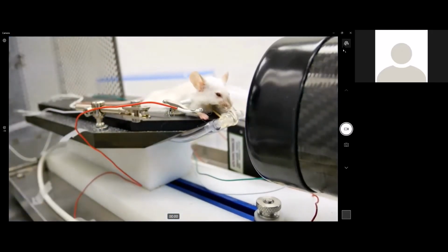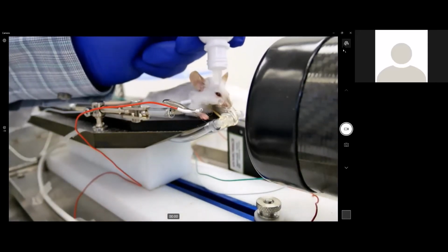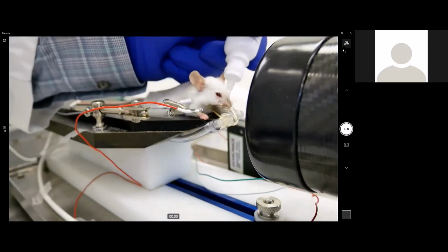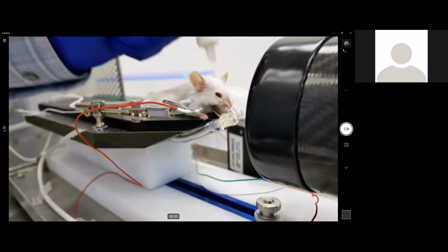I'm going to go ahead and put the tropicamide in the eye. I'm sorry, mydriatic. Proparacaine, the anesthetic.